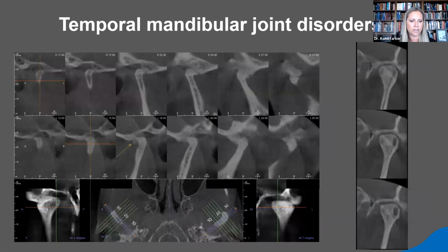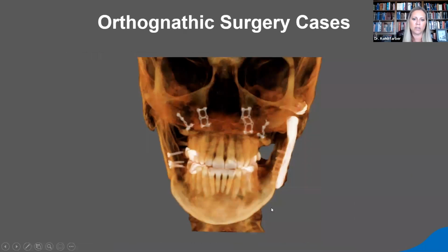And here's some other examples of osteoarthritic changes. Again, we have our anterior osteophyte. Here one has broken off. It's floating in the synovial fluid. That's termed joint mice. If it's one, is it a joint mouse? I don't know. We have subchondral pseudocysts and that sort of thing as well.